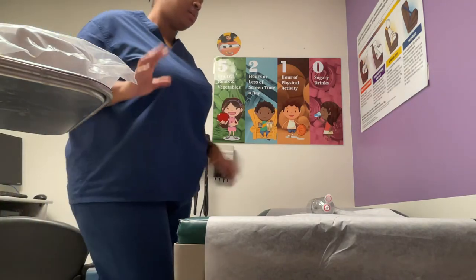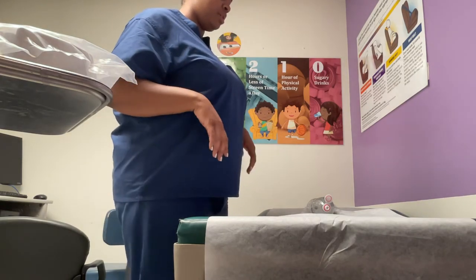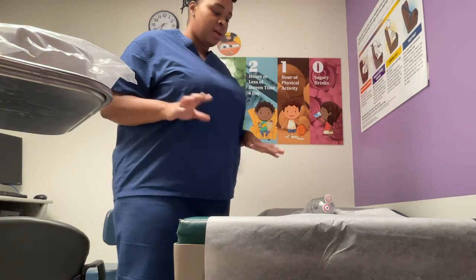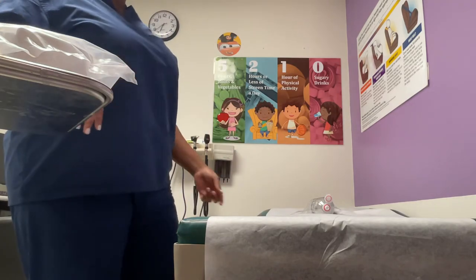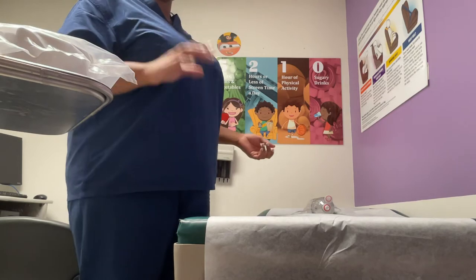Hello, Ms. Nancy, my name is Nurse Williams. I will be inserting your catheter today. Do you have any questions or concerns? I'm going to walk you through the procedure as we go along.